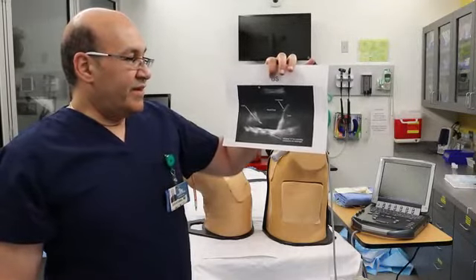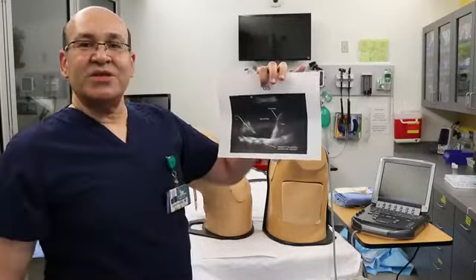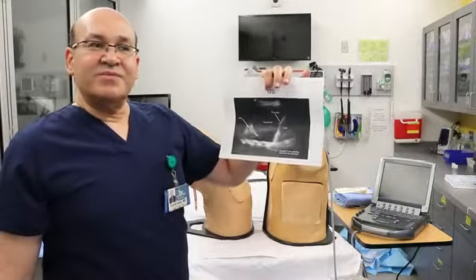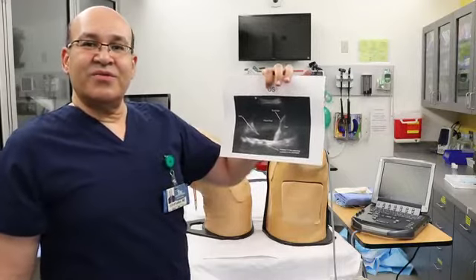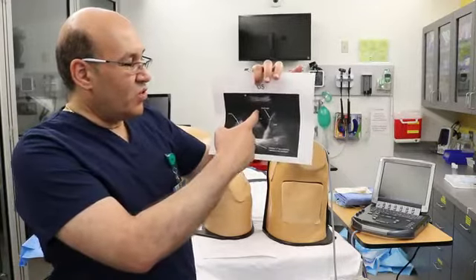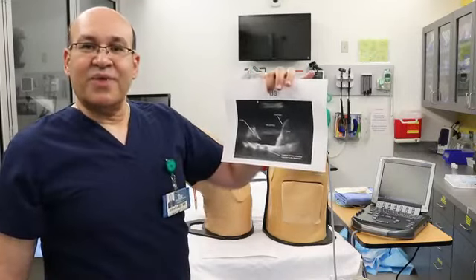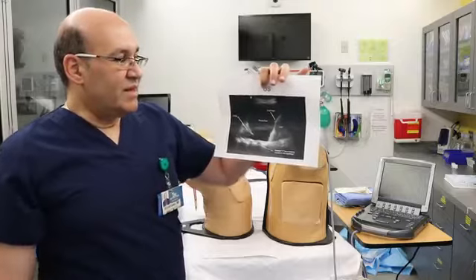One important thing, you shouldn't have the lung in your way. So I may ask the patient also to take a deep breath. Sometimes patients sigh or take a deep breath in the middle of the procedure when you are going with your needle. You want to be sure this spot where I will go, when the patient takes a deep breath, he will not bring the lung to the needle spot. So this is what you will see.